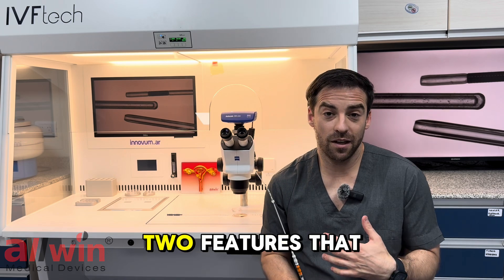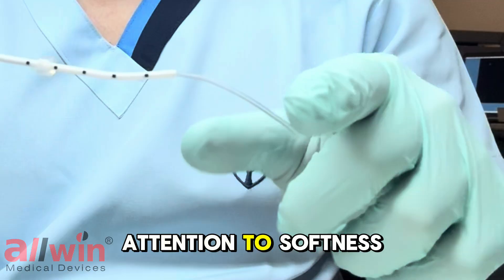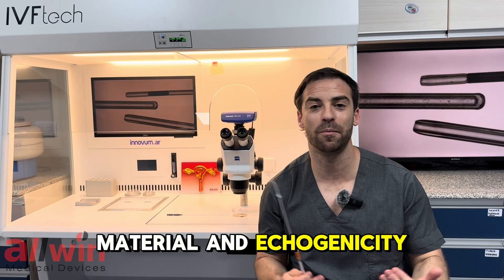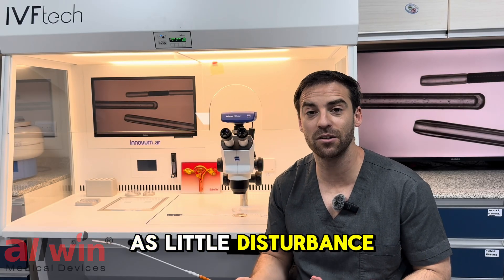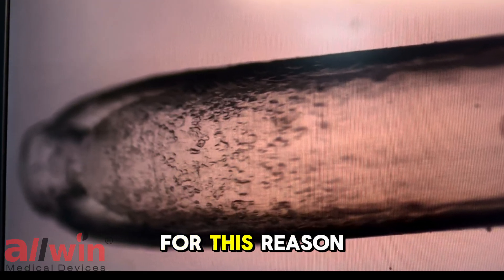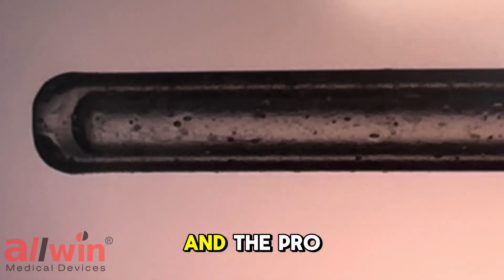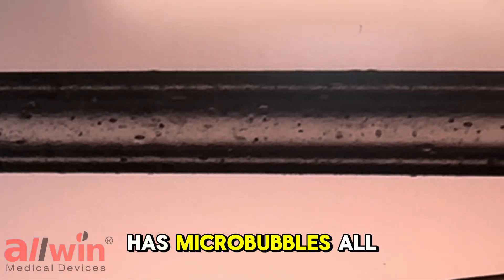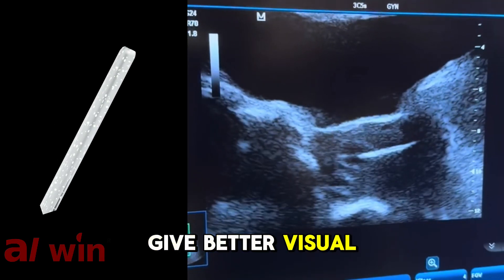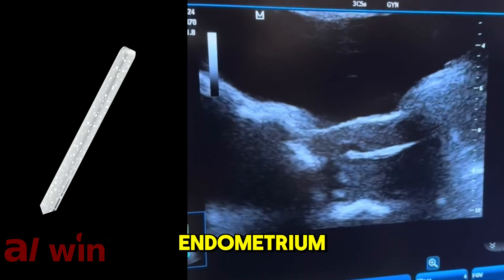Regarding the inner part, there are two features to pay attention to: softness, not only in technical aspects but in the material, and ecogenicity. What we want is to generate as little disturbance as possible and to locate precisely where the embryo is being left. For this reason, the inner part of the Ecotrans and the Pro-Ecotrans has micro bubbles all along the catheter, to give better visualization at the moment of leaving the embryo inside the endometrium.